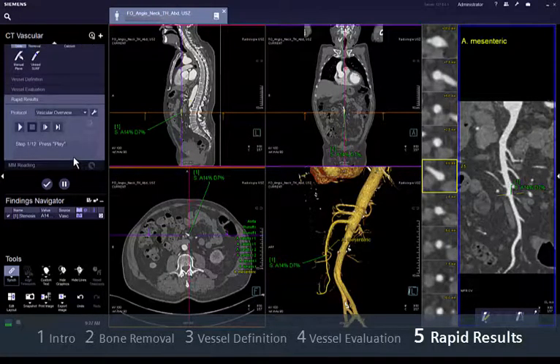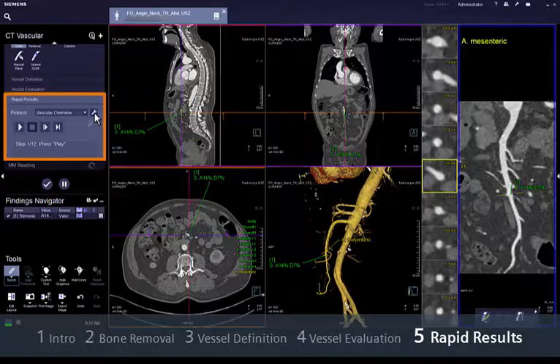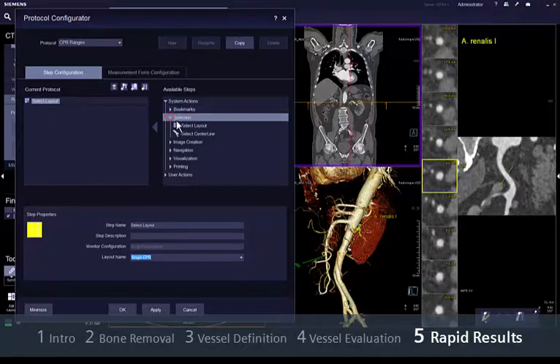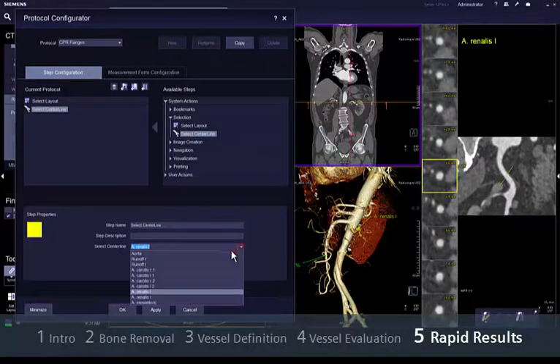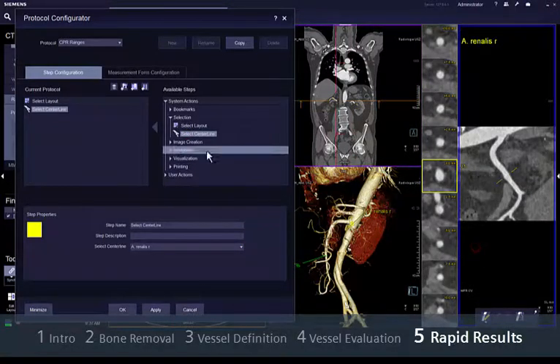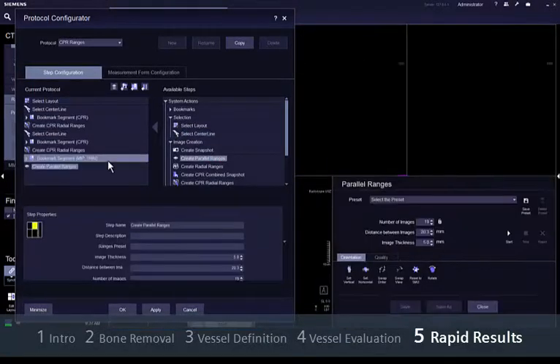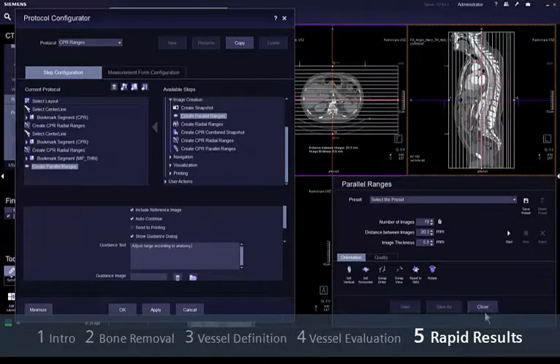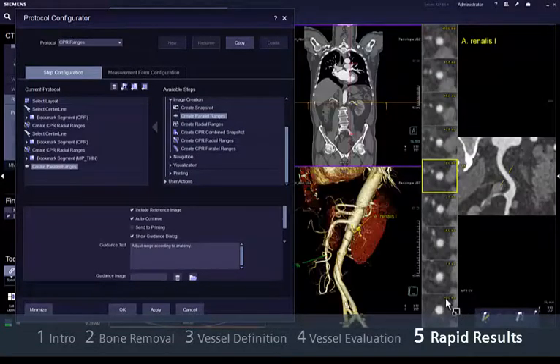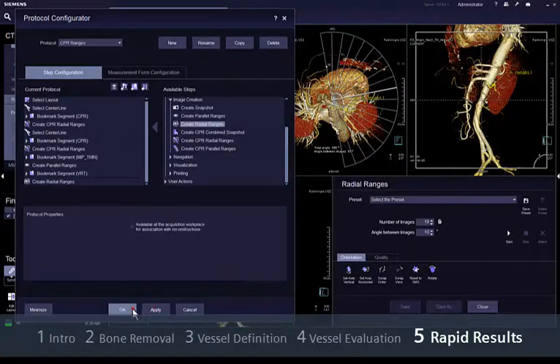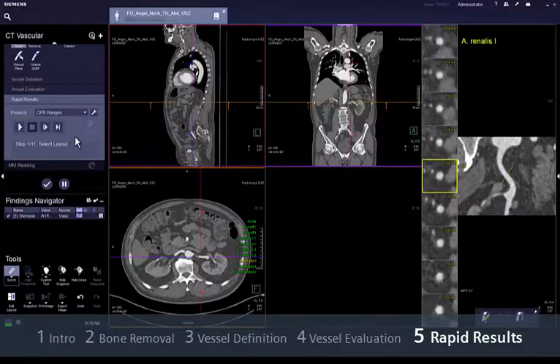For standardisation of your reporting procedure, we have created the Rapid Results step. Here you have the option not only to create a standardised report, but also to define the default reconstructions you would like to perform in every patient. For example, select CPR and create radial CPR ranges for both left and right renal arteries, then change your NPR segment to Mip Thin and add a parallel range step. Remember to choose the desired orientation, then include a radial range step over the VRT segments. Save your protocol, which can then be used every time you need it by just clicking the Play button. Results will be saved in the Series Navigator for further archiving.